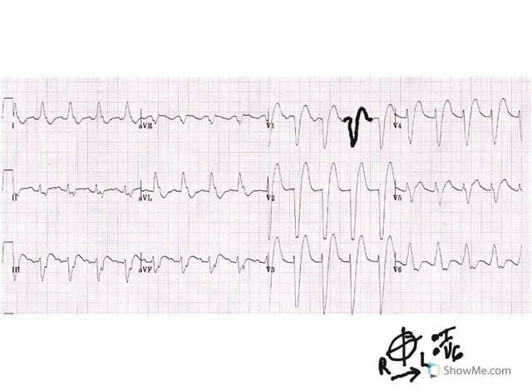In leads 1 and V6, what I should see is almost all upward deflection. And if you look at it, there it is. Look over here at lead 1. You could even look in some other lateral leads. Now V5 is a little tough because it sits on the edge between the lateral wall and the anterior wall, so you're getting sort of an isoelectric here.